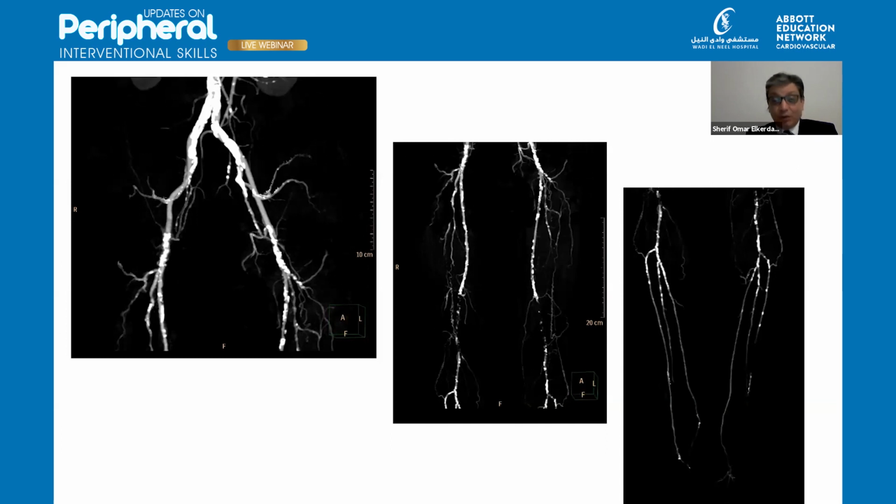And if so, I will choose a right brachial approach if this might hinder his CABG procedure. But the right transbrachial approach is much longer than the left one. So the same situation will be difficult again to go all through the vessel from the right brachial approach. It's a very difficult situation, but we have to tailor every patient according to their situation.